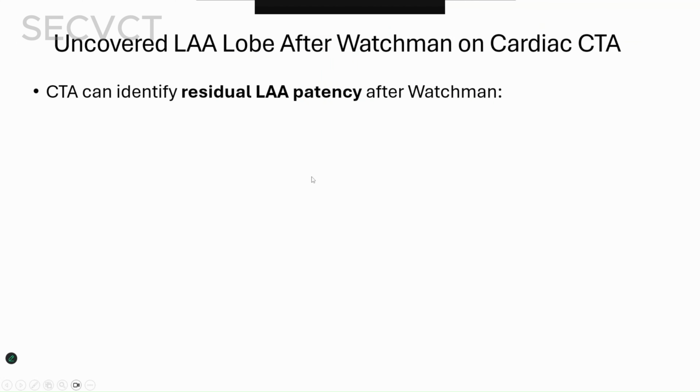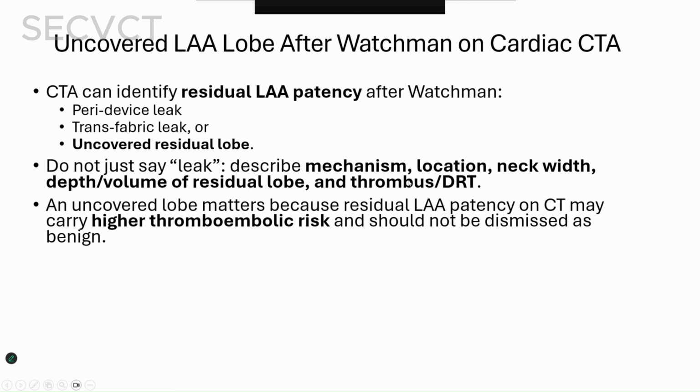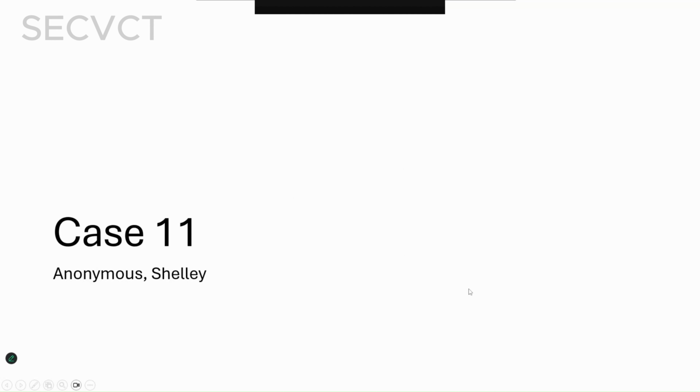So anyway, again, for residual patency, look for the three differentials and try to understand the mechanism more than just reporting there's a peri-device leak, and talk to the operators if there's any potential percutaneous plugs or so. I'm going to stop here and thank you all.